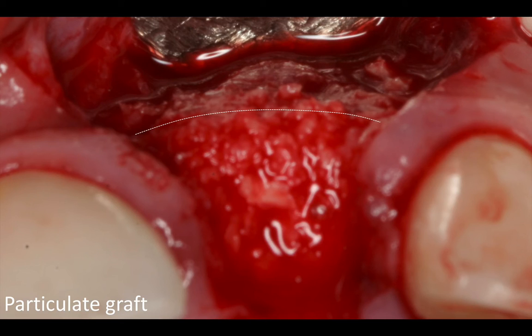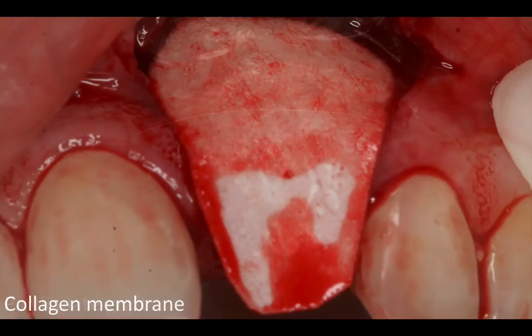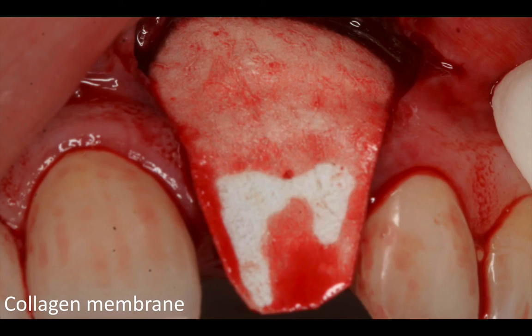Now, in order to retain this graft material, both on the buccal and the occlusal surface, I used one membrane that I reshaped to be fitting slightly over the defect on the buccal and to be folded on top of the occlusal part of the extraction socket. And that's mostly for retaining the graft material.